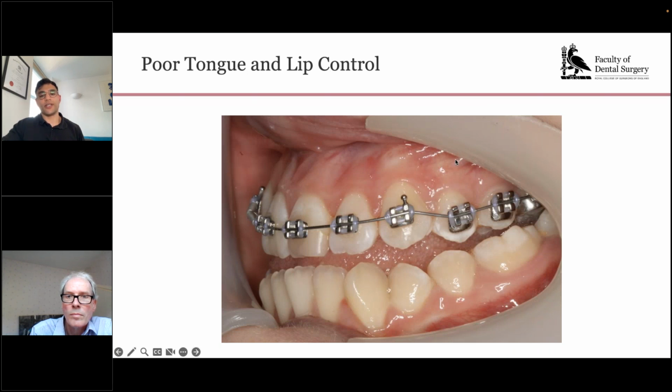That's what attenuates the detail in the photograph, these reflections on the soft tissues here. So if I was doing a lot of soft tissue work, which I'm not, that's where you'd really want to use a diffuser. So you can use loads of light, get the soft tissues as dry as possible, and then use a diffuser so you can pick up the quality, and by quality I mean the texture, of those soft tissues as much as possible.